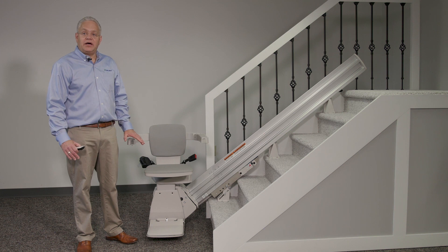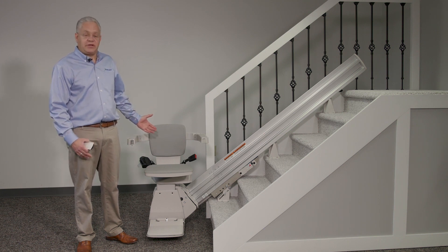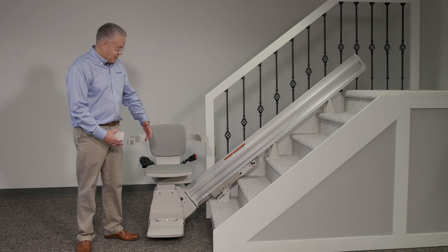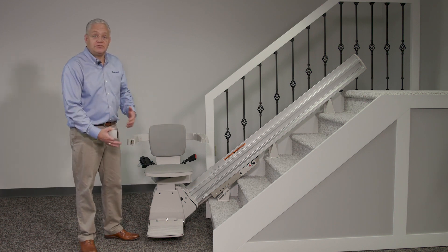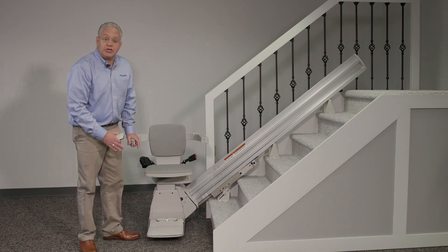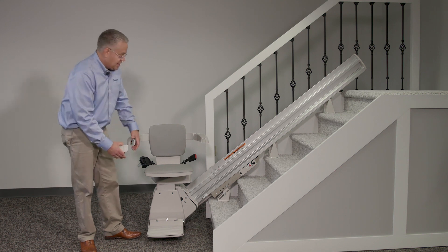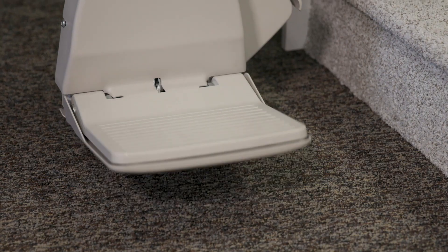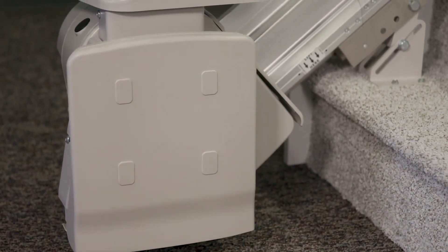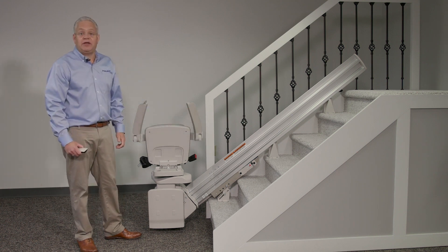One of the big things on a Bruno stair lift is the ability to fold it up and make use of the staircase. On a standard stair lift, you have to fold up all the components, but you have to bend over in order to fold up the footrest. An option would be to order a power folding footrest — you simply pull up on the bottom of the seat, and under power, the footrest folds neatly out of the way, giving you full access to the staircase without having to bend over.